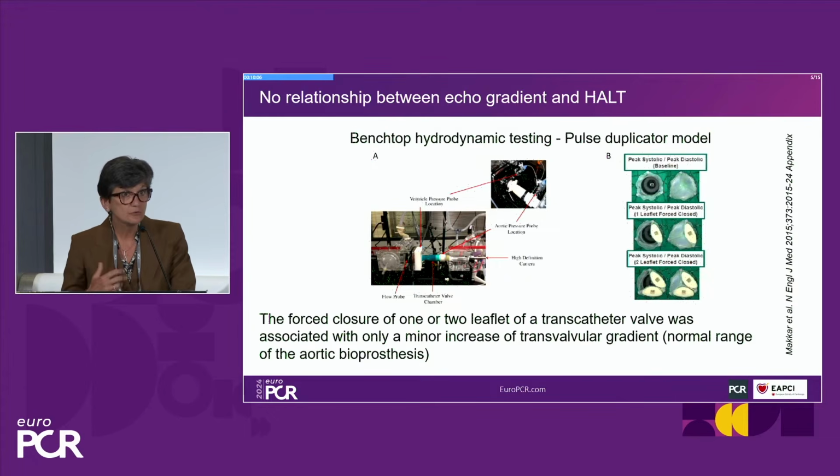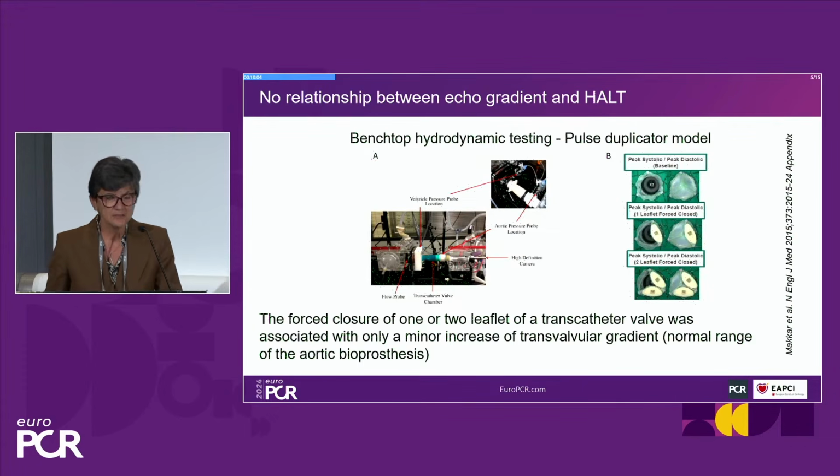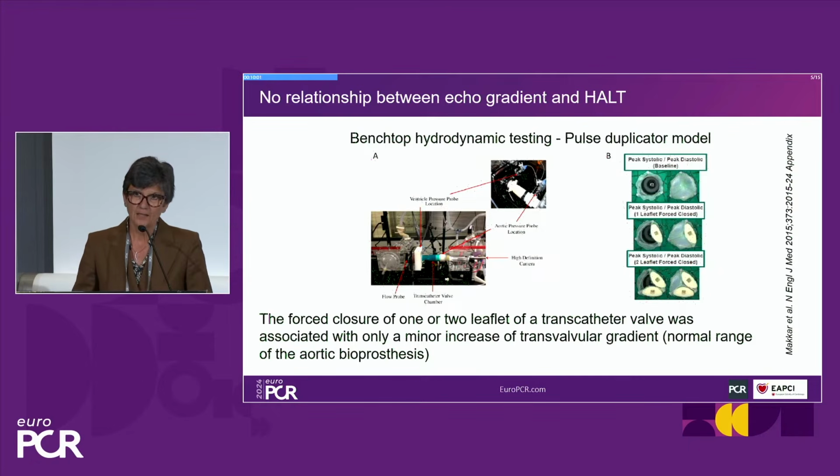So this is really a strange phenomenon, as discussed by Nicolas just before. One first message is that there is no strict relationship between the echo gradient and HALT. And you see how we can explain that. This is a model from the engineers using benchtop hydrodynamic testing with a pulse duplicator model.